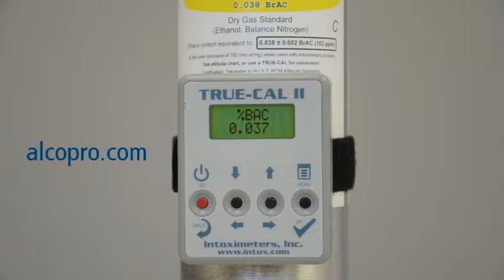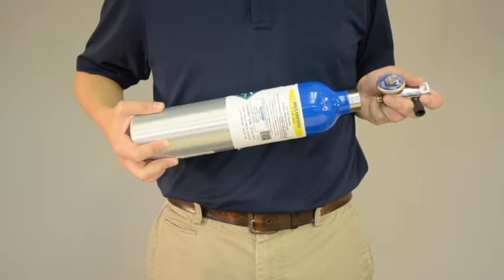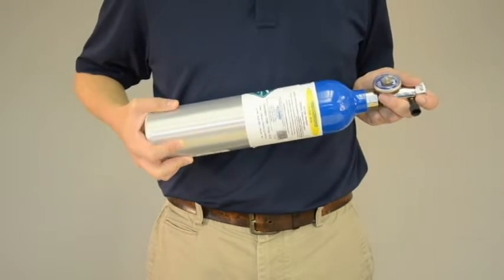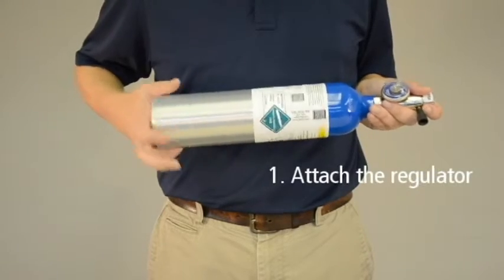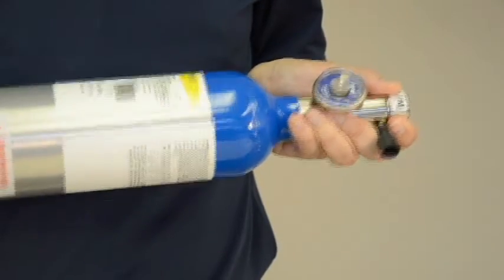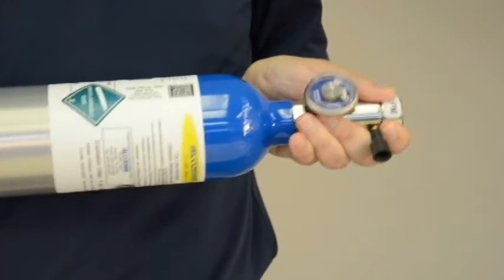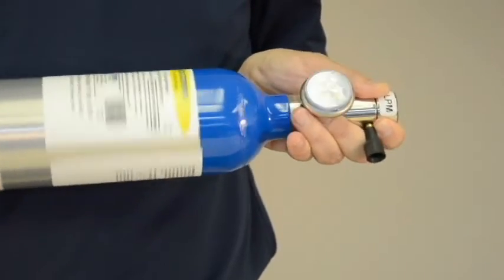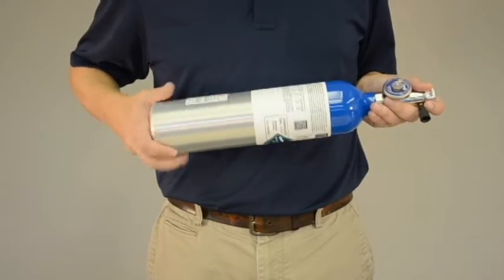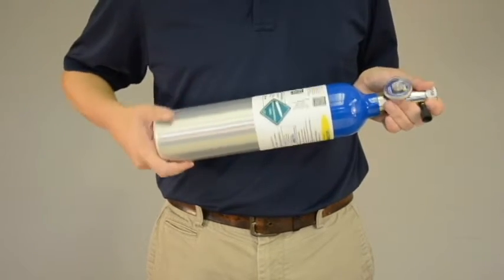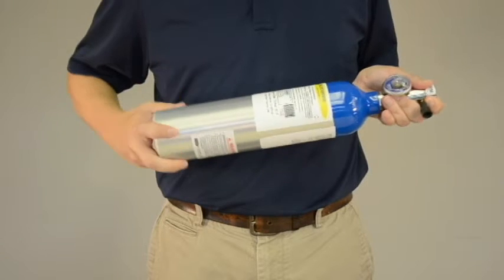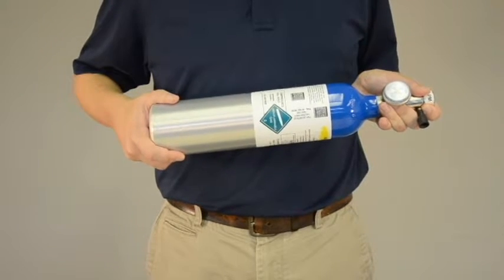Now that you know your expected gas value, you can proceed with the accuracy check. First, attach the regulator to the dry gas tank. For safety purposes, point the regulator end of the canister away from your body and away from others. Twist the regulator securely in place, making sure you don't over-tighten. You may hear a pop or hiss sound as you tighten the regulator. This is normal.